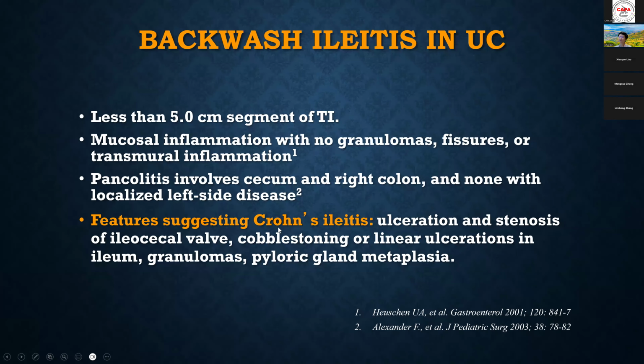But for Crohn's, you see more severe inflammation. And usually the ileitis is more severe than the colitis in the cecum. And usually you will see ulcers, stenosis, granuloma, and pseudopyloric metaplasia. Okay.